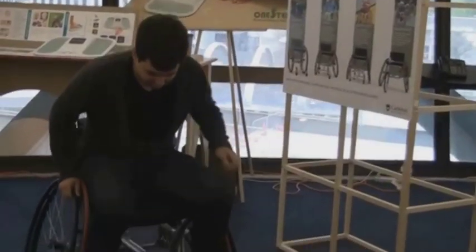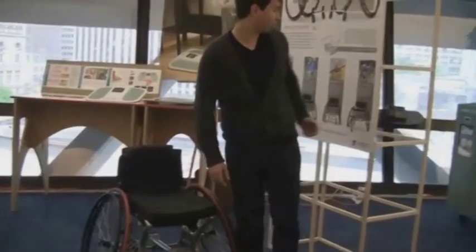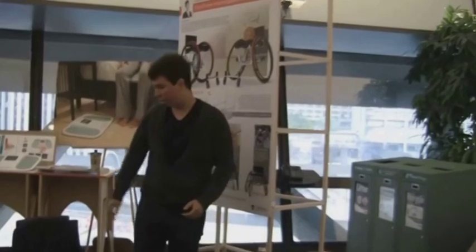The chair also has an interchangeable front end here with a quick release mechanism. There are different front ends that I've designed, such as a tennis front end, a basketball front end, and a track use front end.